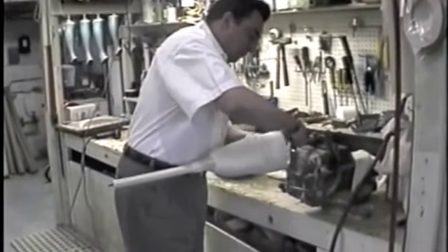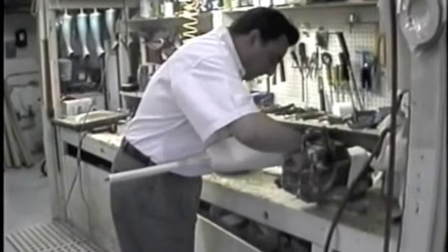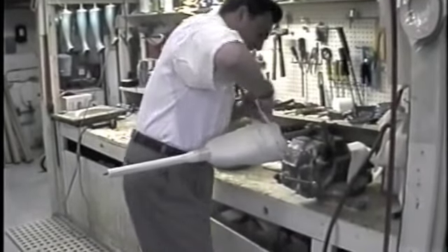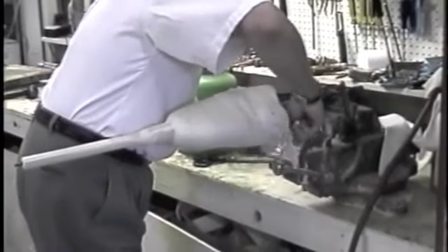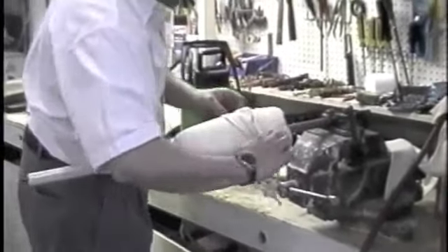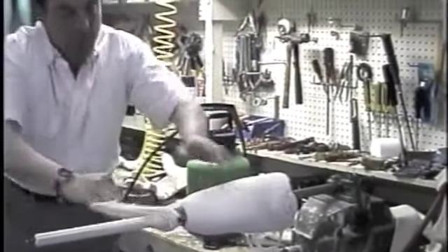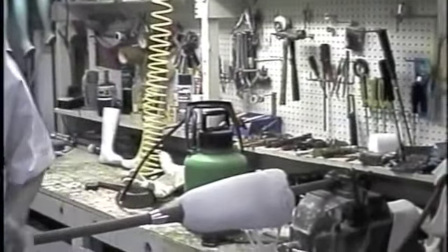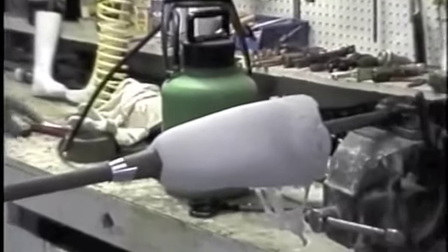Okay, this is the first one that was removed, and I want to show you the breakdown here. I'm going to take this all apart. The best time to disassemble this whole deal is right after you pull the plastic off it. Because if you take a good look at this, zoom in on this, you'll see that the imprint from the stockinette is now in the tape. So you can see how it's compressed that tape and relieved it from tension.